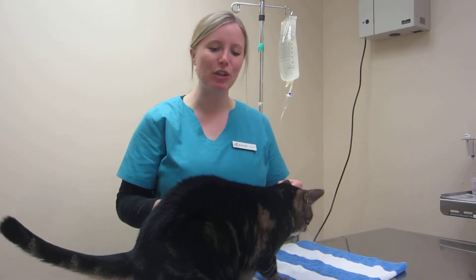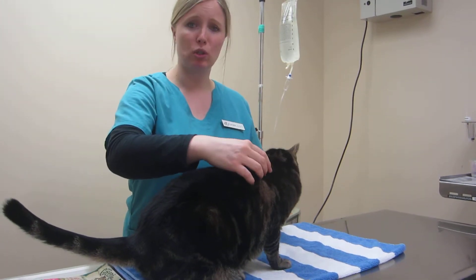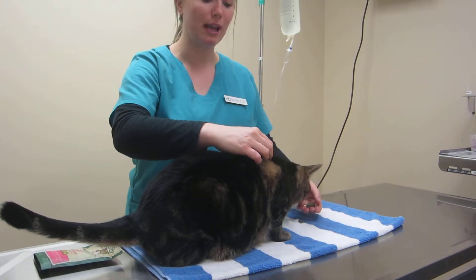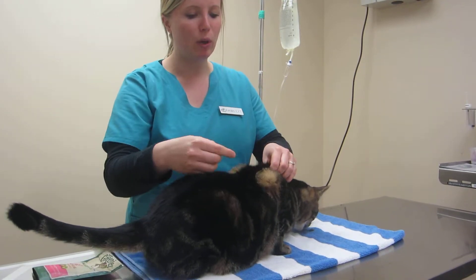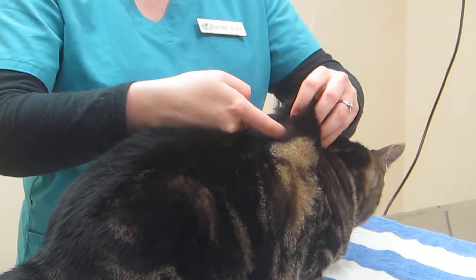While he's enjoying his treats, I'm going to show you. We're going to go ahead and put his fluids under his skin between his shoulder blades — that's really the most common spot for cats and dogs. They have a lot of space under their skin. So you want to pull it up like a tent; that's what's important. And you want to go ahead and put the needle at the base of that tent.